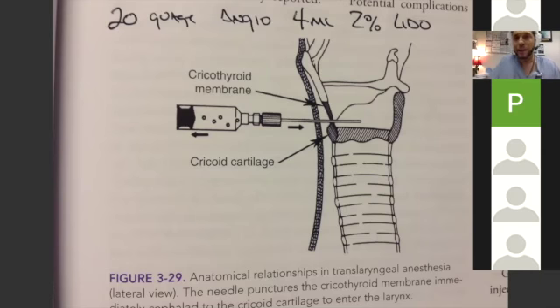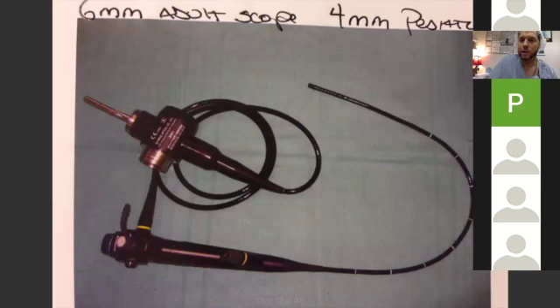So basically, if you have an angiocatheter in your cricothyroid membrane and it fits the wire, make sure you don't put a 22 gauge angiocatheter. It would have to be like a 16. If the airway is really bad and you say this might turn into a surgical airway, you could slide the angiocatheter in and put your local that topicalizes. And now if you got into trouble above, you could always put a wire through there and you've already had that area set. So I've never done that, but it's a point that I've heard at a few airway conferences over the years. All right, let's talk about our equipment.